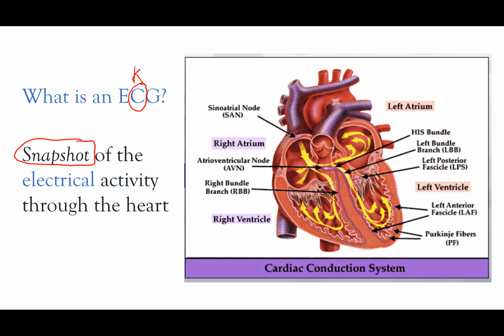And then you can see if there's a change when the patient's actually having symptoms, because you really want to get that snapshot when the patient is feeling whatever the symptom is: lightheadedness, palpitations, chest pain, whatever. Okay, and then of course back to the electrical activity.